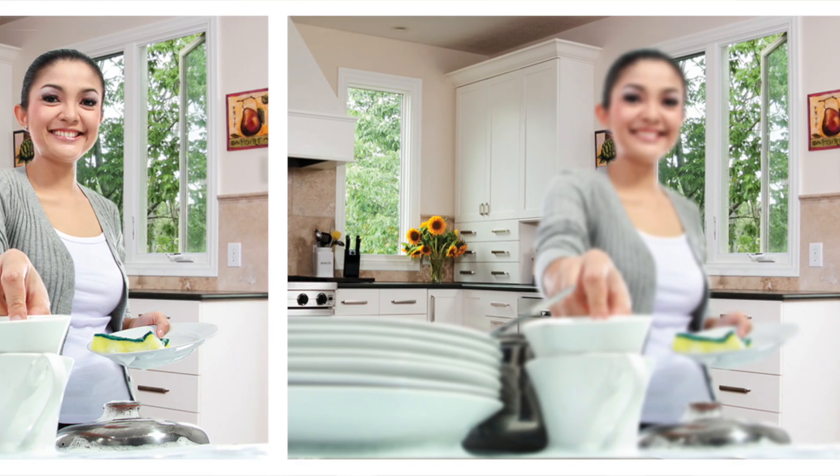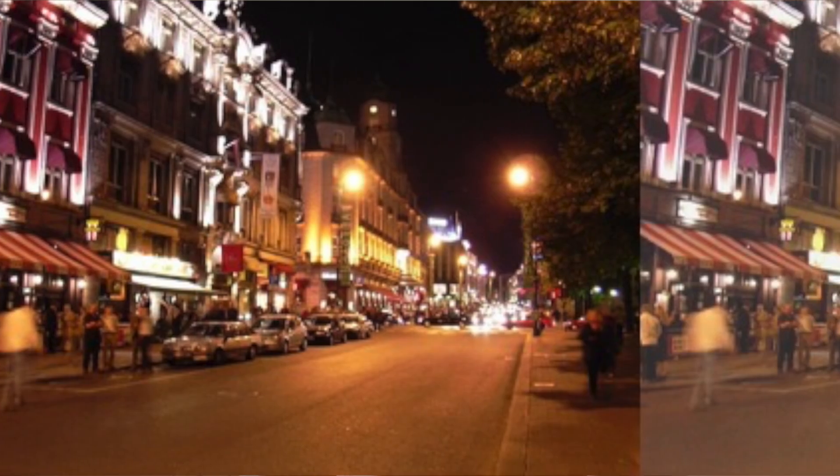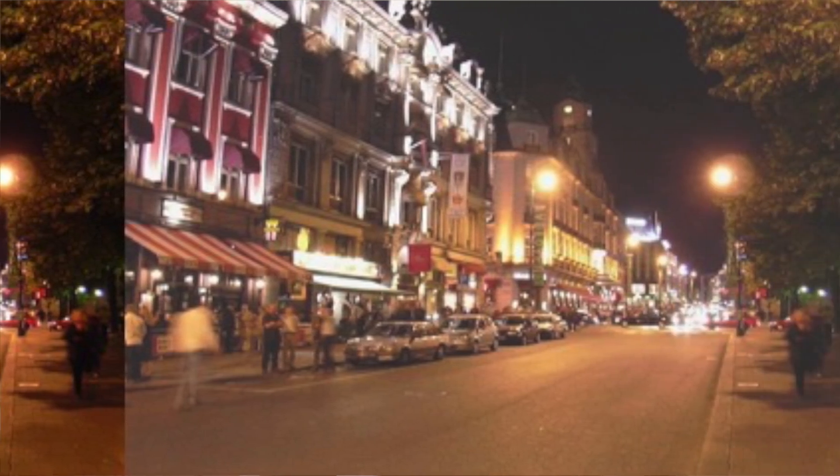First of all, let's recall what the point of vision correction with an intraocular lens is, beyond just restoring transparency to the optical media of the eye when treating cataracts. Why is it important to talk about this? Because Vivity isn't just a regular artificial lens that simply replaces a cloudy lens with a clear one. Vivity belongs to the premium segment of intraocular lenses, whose purpose is to restore the highest possible quality of vision and provide a greater degree of independence from glasses. A combination of visual acuity at all distances and in all lighting conditions, plus contrast sensitivity — that's what defines the basic vision quality we expect from a young, healthy eye.